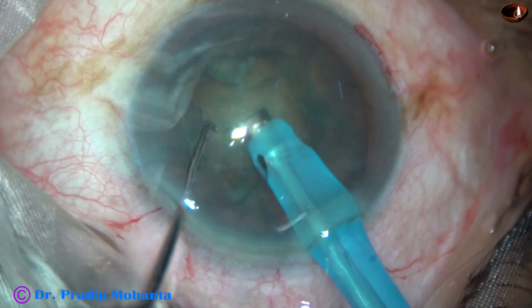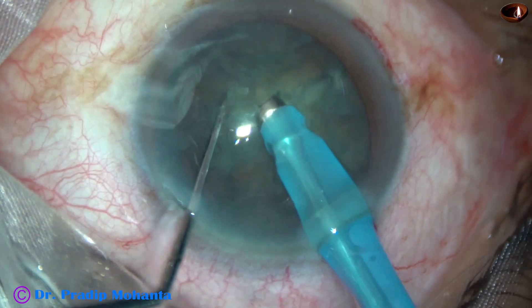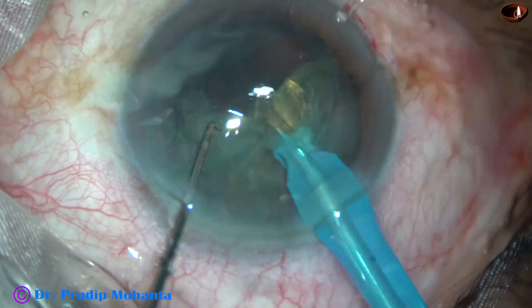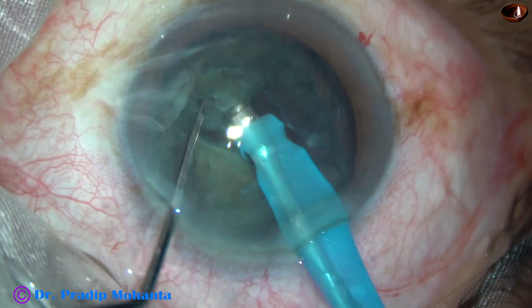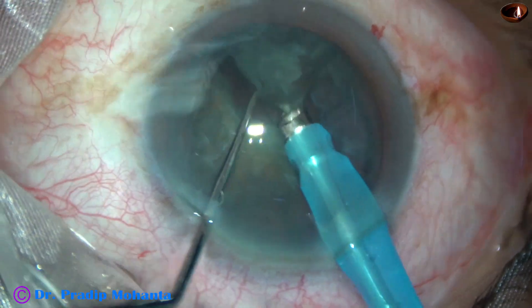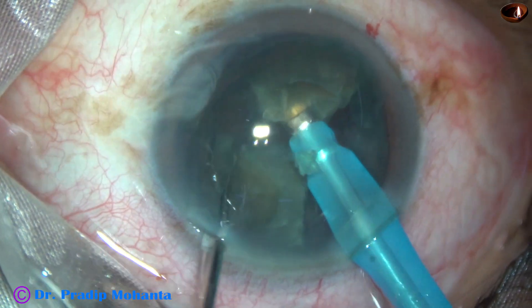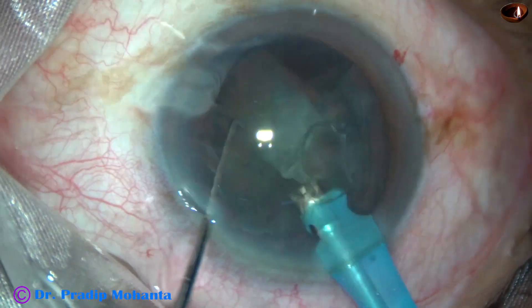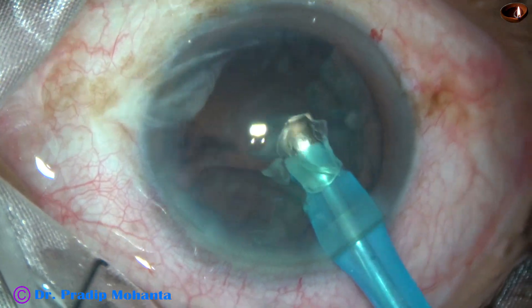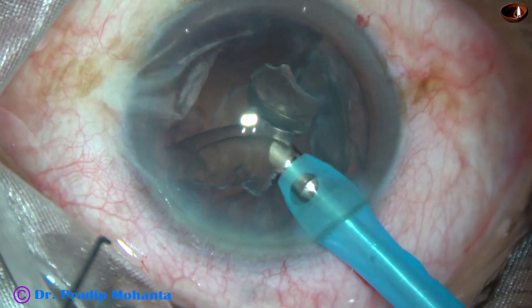The tip is buried in the substance of the nucleus. And when the cataract is of this consistency, we can hold only the central part. If we cross the central part, we may not be able to hold because the peripheral part has softer nuclear material. One hemi-nucleus is already removed. This is the other hemi-nucleus. FECO power used is 60%, flow rate is 45 ml per minute, vacuum is 450 mmHg. And now, the epi-nucleus.